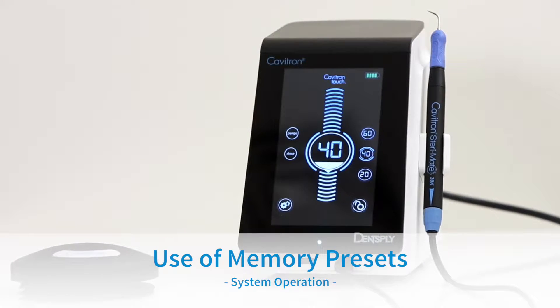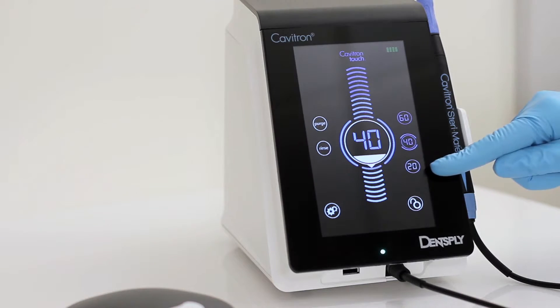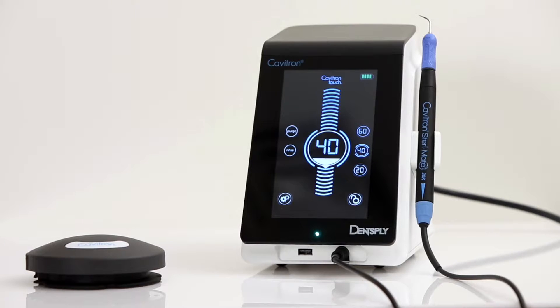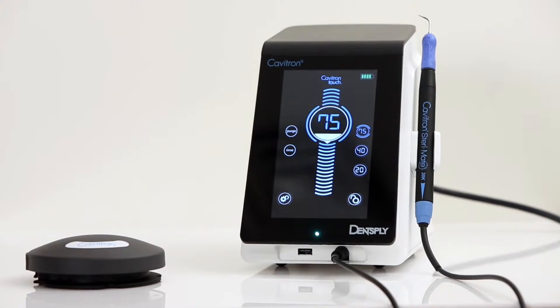Use of memory presets: The user can adjust the power level for increased power. 3 power preset options are available. The factory settings for the presets are 20, 40, and 60. Please adjust the power level to your desired output and press and hold the preset button until the sound indicator is heard to select the desired preset.